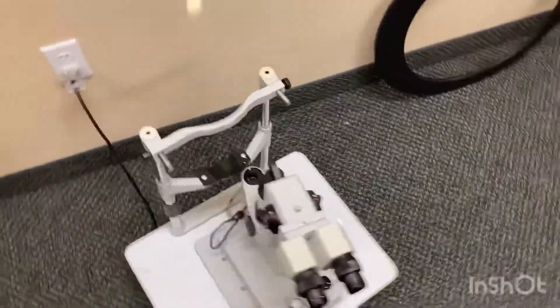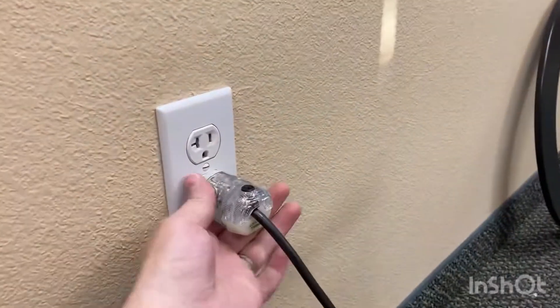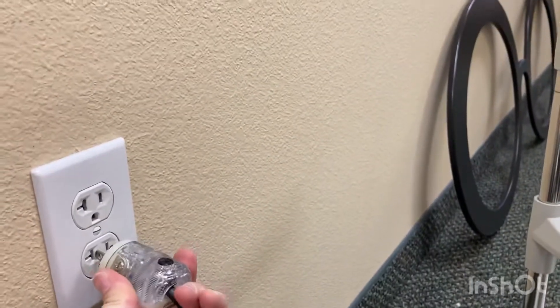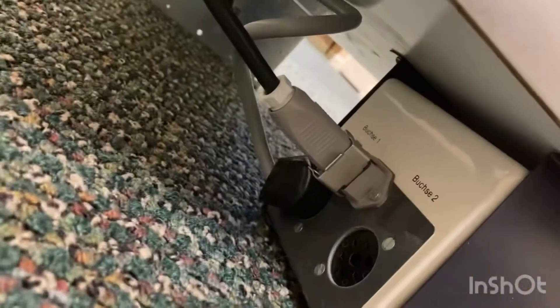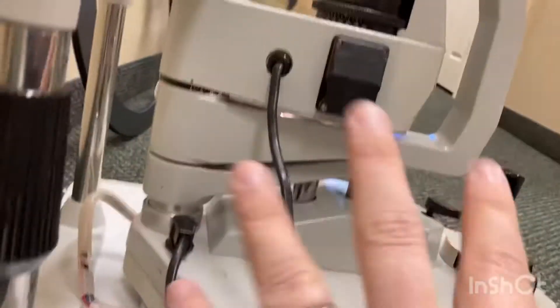This is the Rodenstock Slit Lamp. It went ahead and got a standard normal plug on it — goes in, and as soon as it goes in you can see the light comes on, so it's working. That goes down under here and plugs into the power box right here, to the normal plug in the wall, and then this extra one comes out the side and up and powers everything up here.